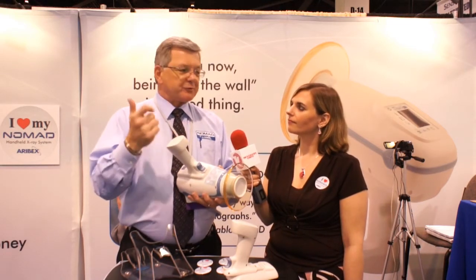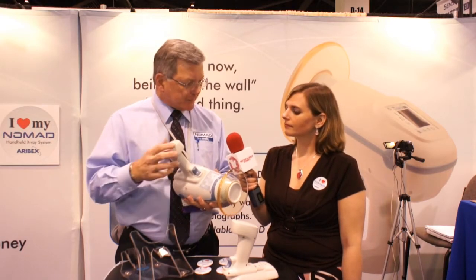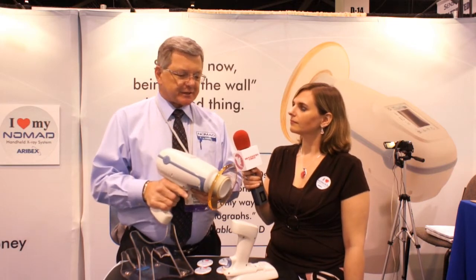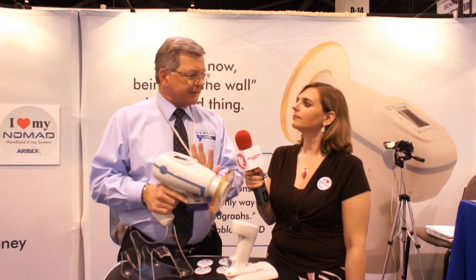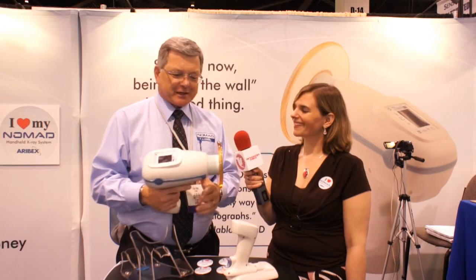It works with sensors, works with film, works with phosphor plates — so whatever your imaging receptor is, it'll work with it. There are about 400 exposures per charge. We have about 9,000 units in the marketplace as of just recently, and we're well on our way to 10,000 later this year with a big celebration planned for that.